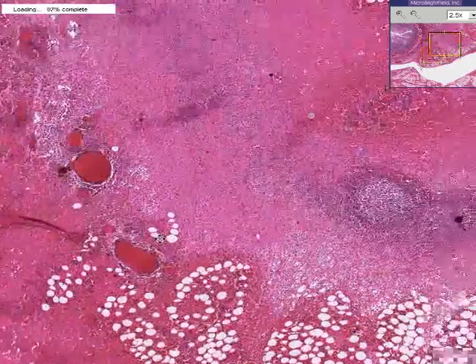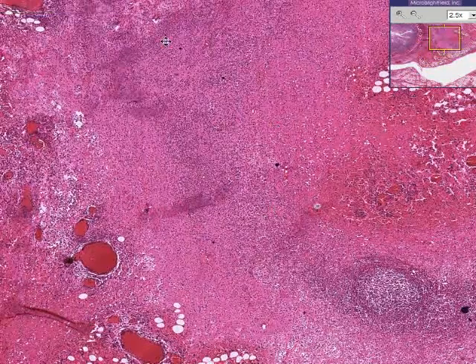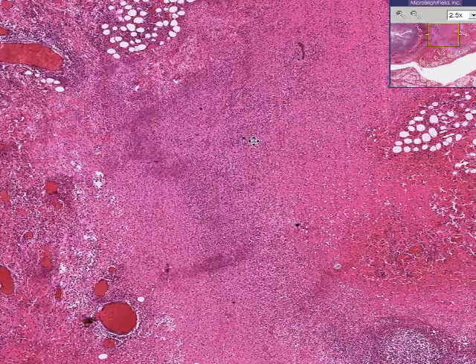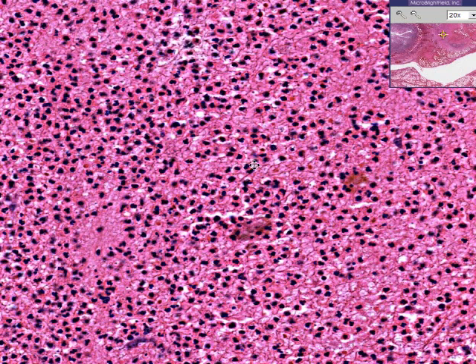And I think you will agree, here is a large lymphoid follicle here, but I think you will agree that if you basically look at the majority of this stuff here, it's nothing more than acute inflammatory cells and fibrin. And I think you could agree that when you look at these cells at first, they may look like they have relatively round nuclei, but when you look at them closer, almost every one of them has a fairly lobulated appearance, and therefore they are neutrophils. So this is a periappendiceal abscess.